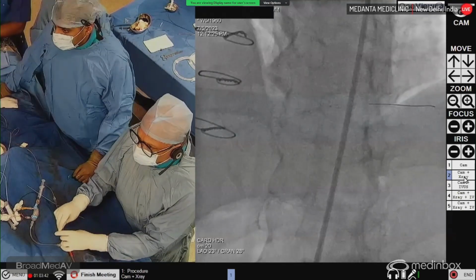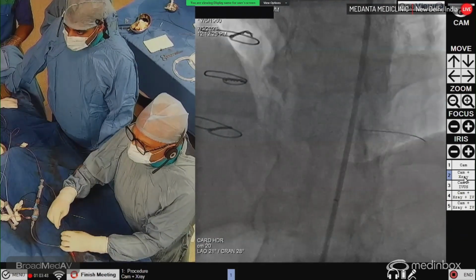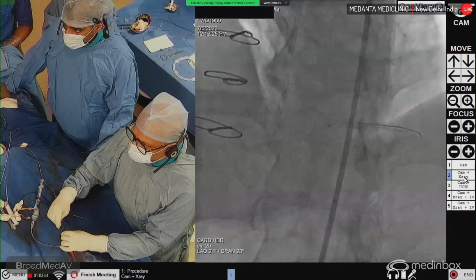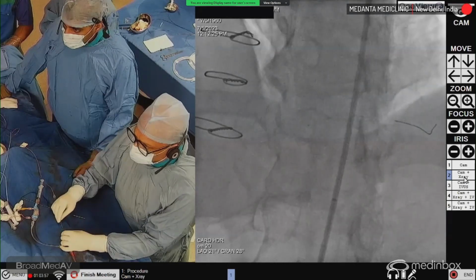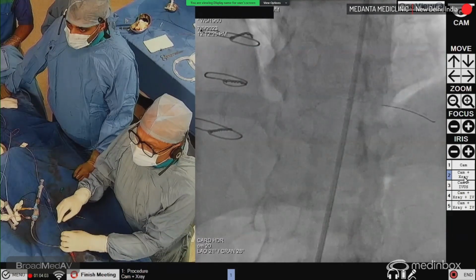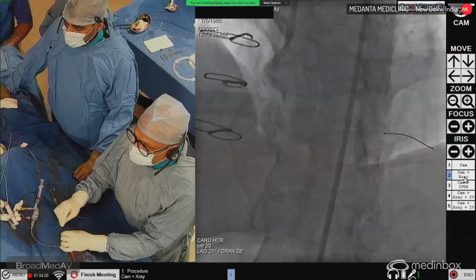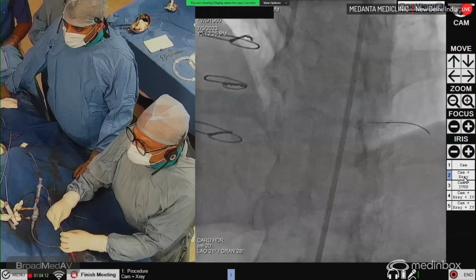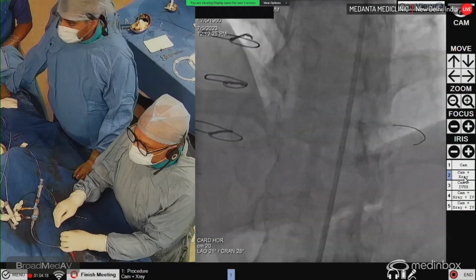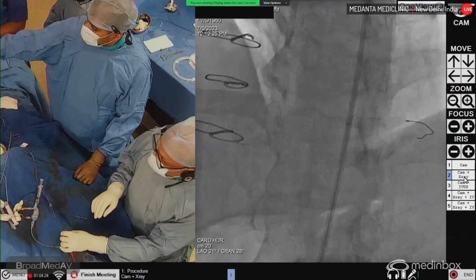So it is having some difficulty. I can see that the wire is pulling back a little bit. Check. Okay. Okay, so the guide liner is inside, which is our guide extension catheter. And now you can see that the balloon moved so easily inside. Okay. Yes. So our stent is very much, the balloon is inside the stent. And now I can pull back the guide extension.